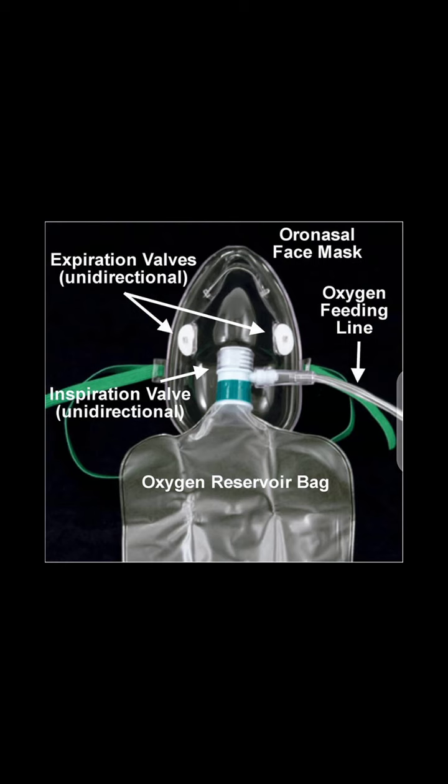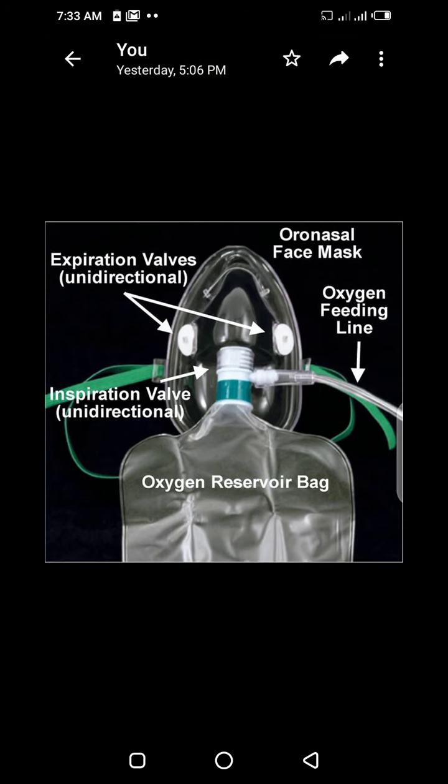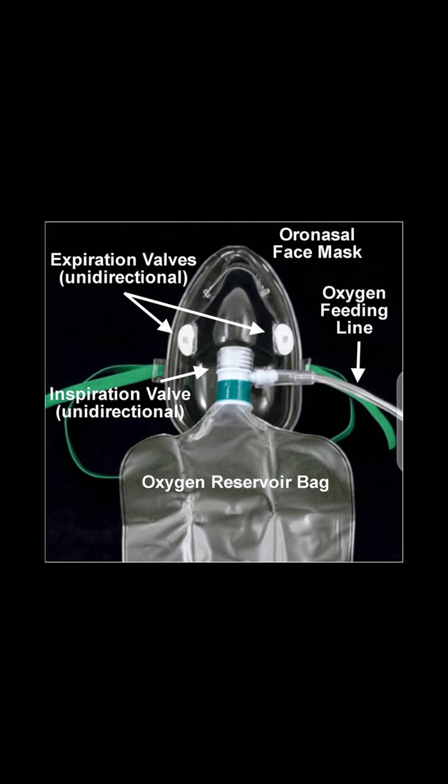Now, the oxygen flow rate that is set when administering oxygen via non-rebreathing face mask is higher than that of a simple face mask. Usually it is between 10 to 15 liters per minute, because it is that range of oxygen flow rate that can help to fill up the reservoir bag with enough oxygen for patients to take in.